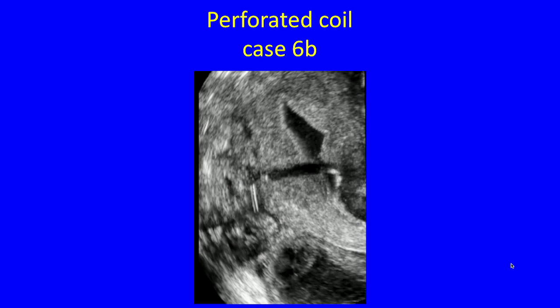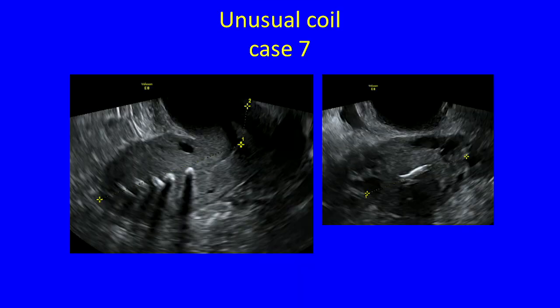It's obvious, isn't it? This is the endometrial fundus. This coil is here and is perforated out, and it is sticking through the serosa. So it's perforated out backwards, and that's obviously done at the time of insertion. That doesn't happen afterwards.